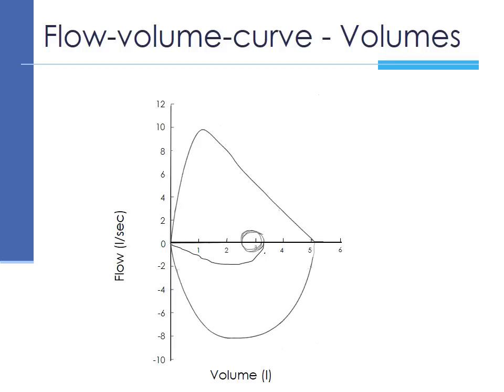Okay, now we'll take the flow volume curve and look at the different volumes that can be obtained when analyzing this curve. First of all, the bottom part of the graph, if you can remember, was drawn during inspiration. As the graph was being drawn, normal breathing was taking place over here, 4 normal breaths, 2, 3, 4, and then inhalation.